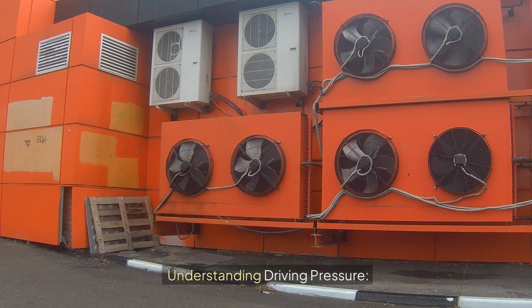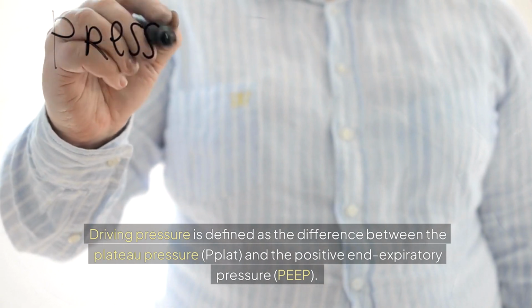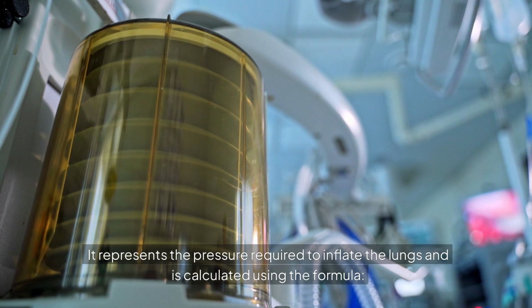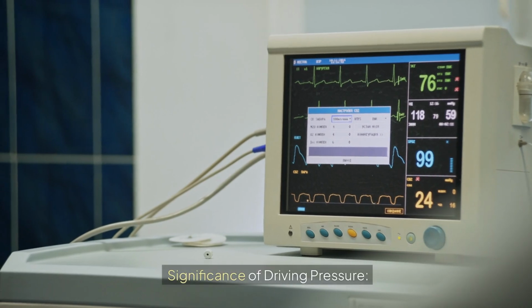Understanding driving pressure. Driving pressure is defined as the difference between the plateau pressure, P-plat, and the positive end expiratory pressure, PEEP. It represents the pressure required to inflate the lungs and is calculated using the formula: driving pressure equals P-plat minus PEEP.